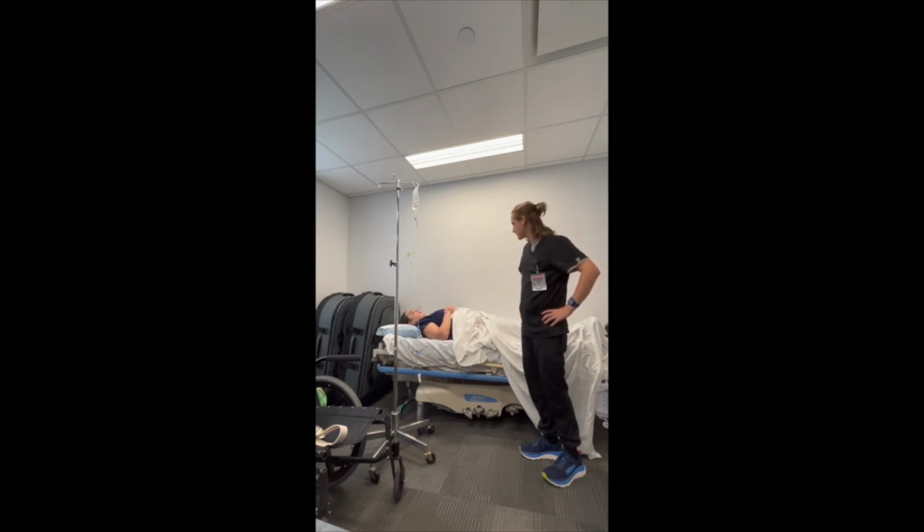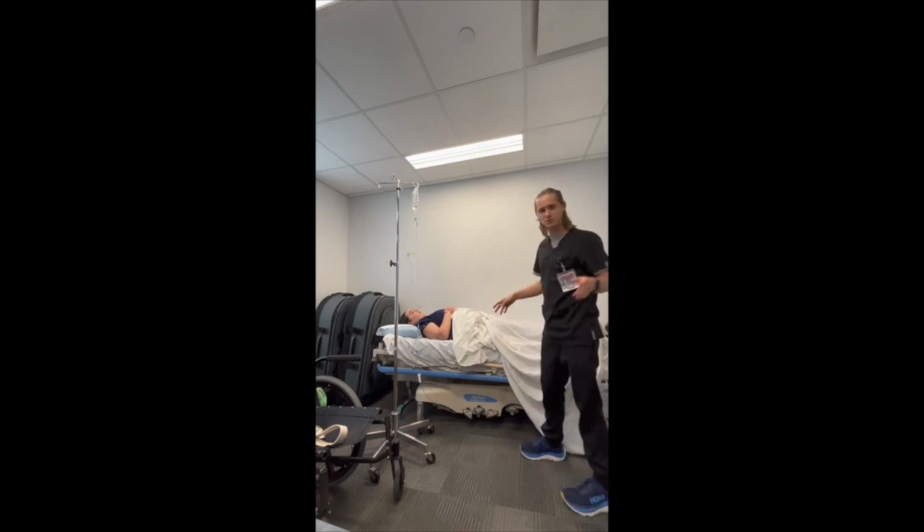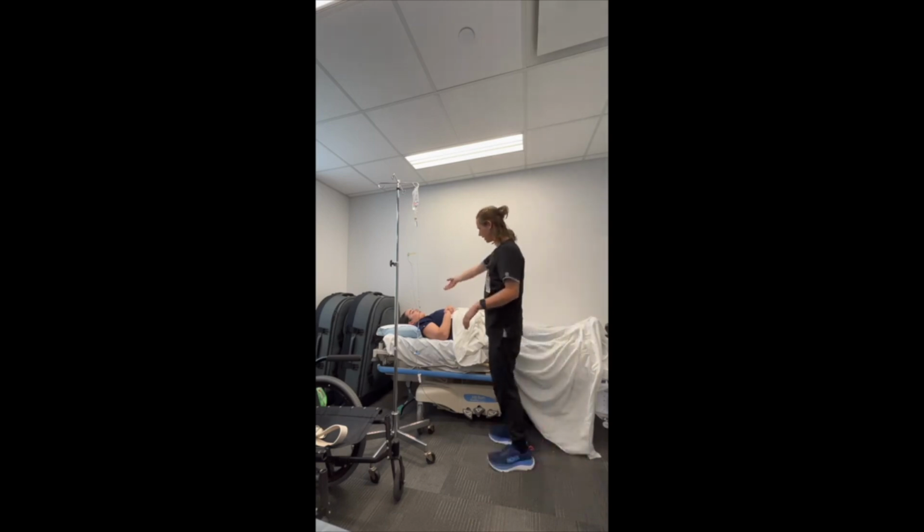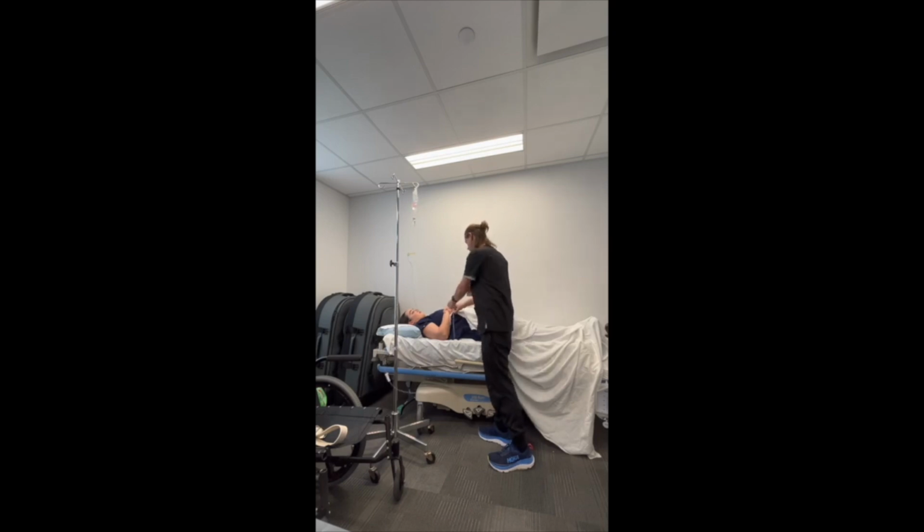So right now we've got a patient supine in bed, and we want to go through our checklist of what to make sure we have in order before mobilizing. So the first thing we want to do is visualize every line and tube. So here we have oxygen running up to the wall. We've got an IV coming from a pole here. So we want to see that that's going, you can raise your arm up for me, to her left arm.